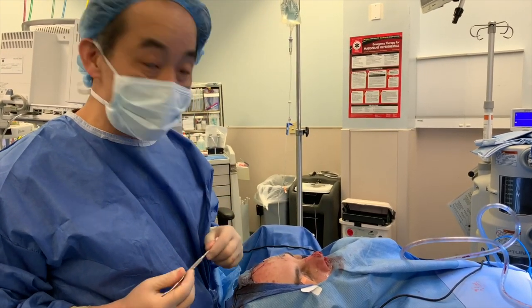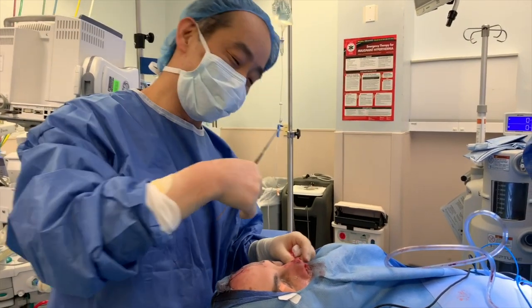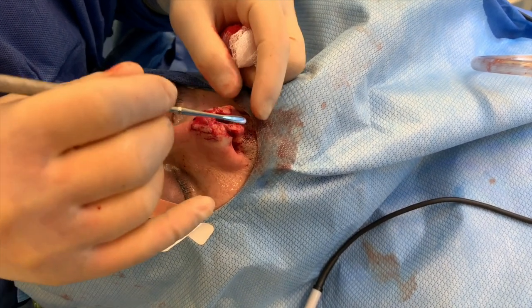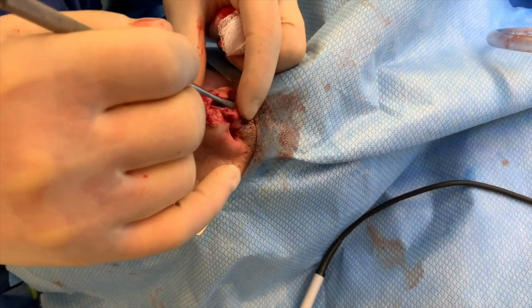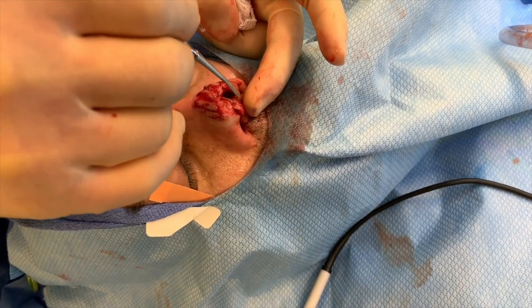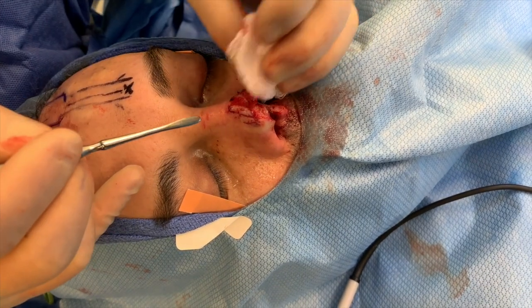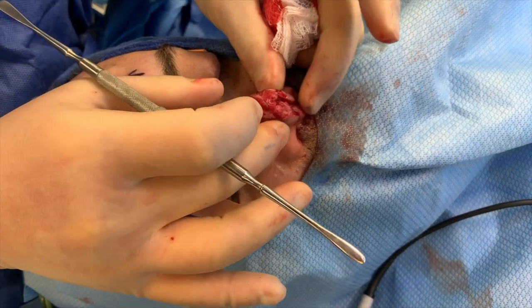This gentleman was bitten by a dog — a German Shepherd — and you can see that the tip of his nose is missing. He's missing cartilage here and here. This is the alar cartilage, which usually forms a dome, and he's also missing the columellar cartilage, which is the support structure for the nasal tip. All of those structures are now missing in addition to the soft tissue that usually creates a nice rim, so we can't just close it, because his nose would be very pinched up and depressed.